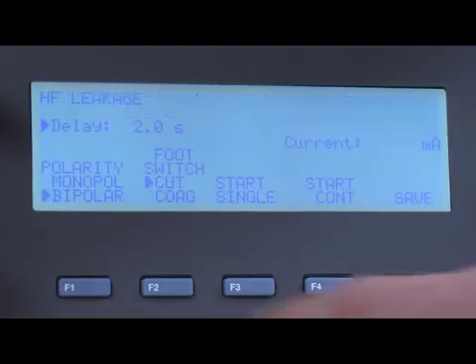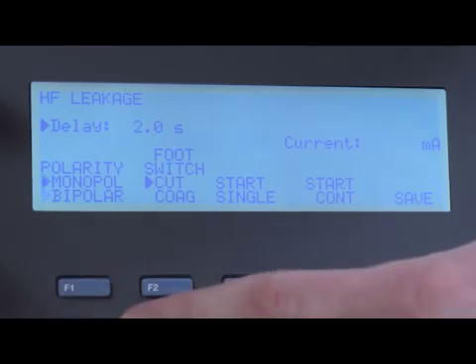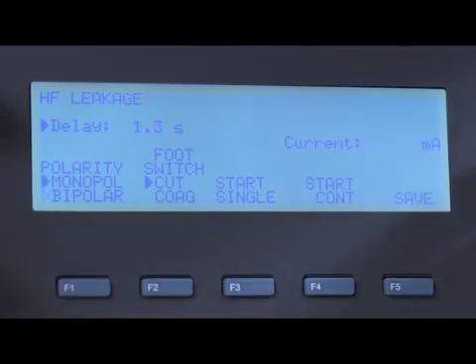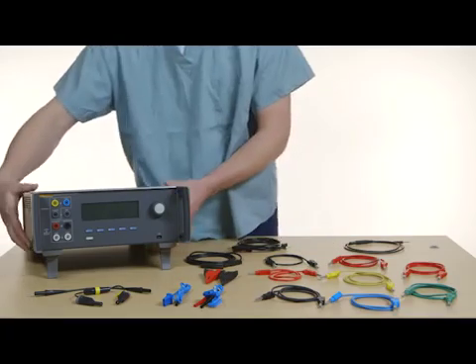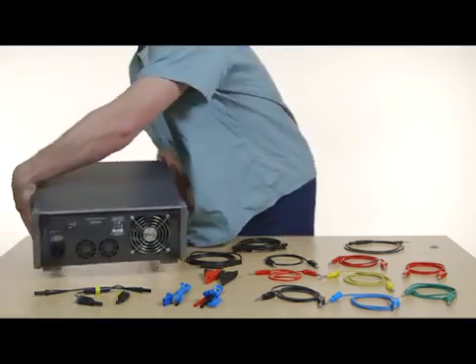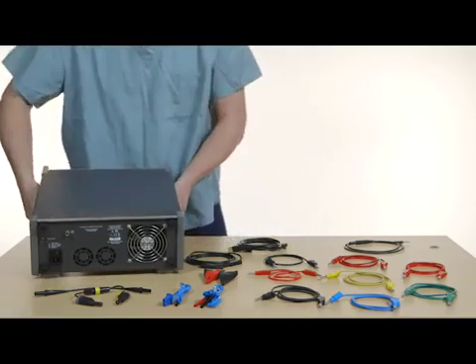The large LCD screen is easy to read, and on-screen guides are designed to guide you through testing. When you pick up the QAES-3, you'll quickly discover it's lighter than the previous version — 5.5 pounds lighter.